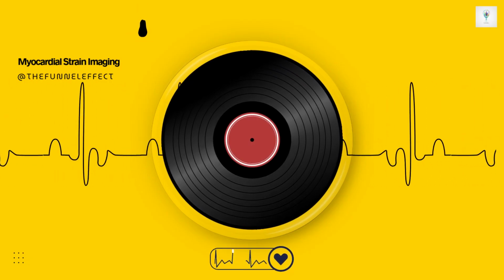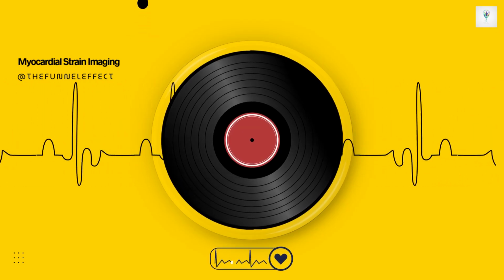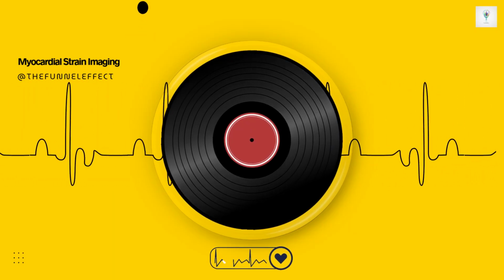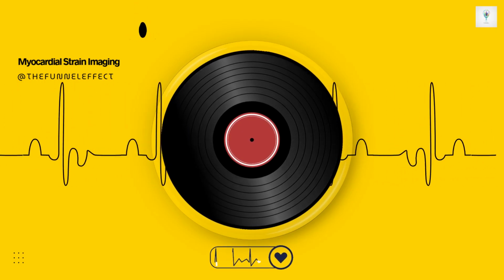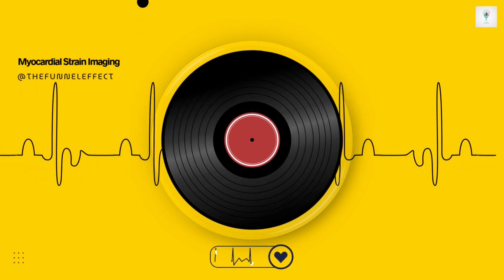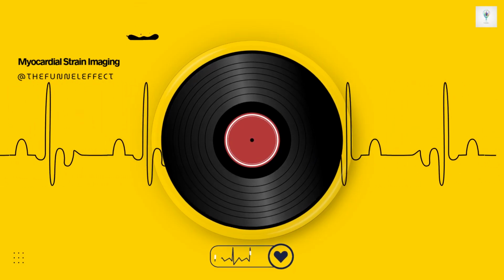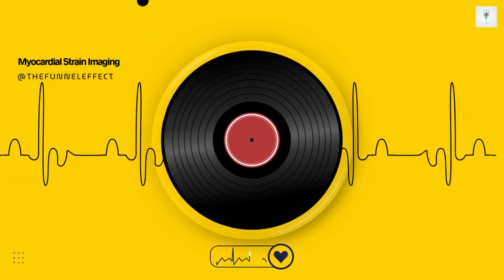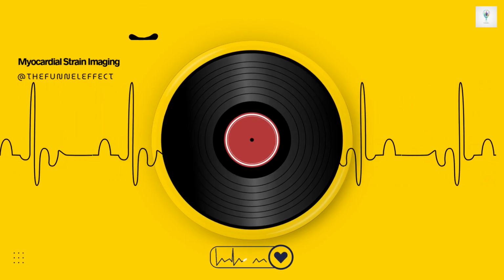Is there a clinical threshold for LA reservoir strain that raises concern? Yes, several studies suggest that an LA reservoir strain value less than about 18% is a strong indicator of elevated left ventricular filling pressure, suggesting a pulmonary capillary wedge pressure likely greater than 12 millimeters of mercury. It's a useful non-invasive marker. What about the LA pump strain, measuring that active contraction at the end? LA pump strain measures that late diastolic booster contraction. While it does reflect atrial contractility, it's highly sensitive to the LA afterload, which is the LV filling pressure it's pumping against. So high filling pressure makes it harder for the LA to pump.